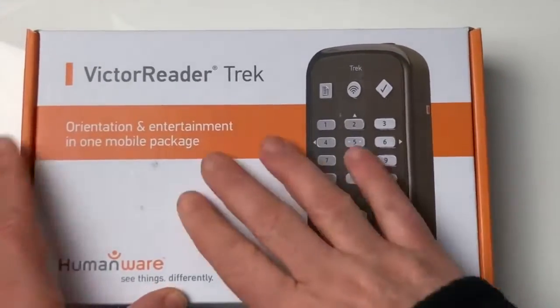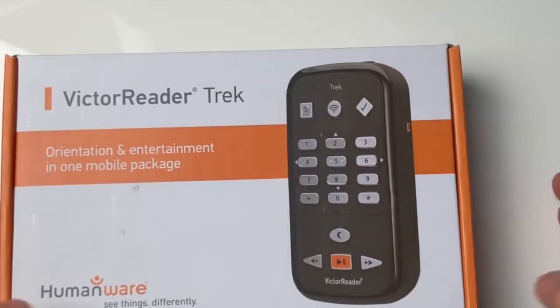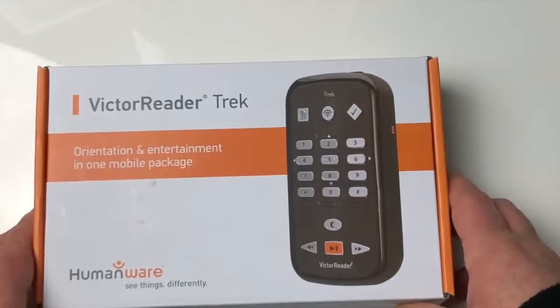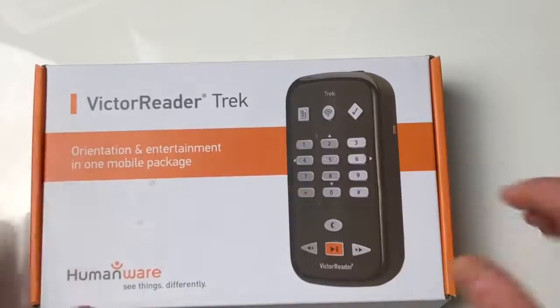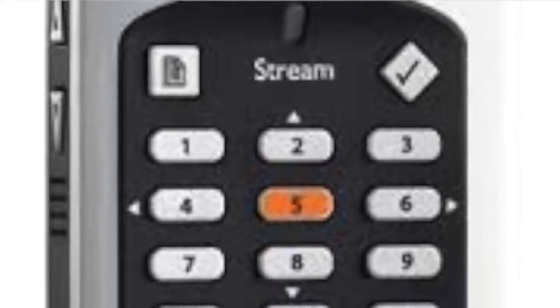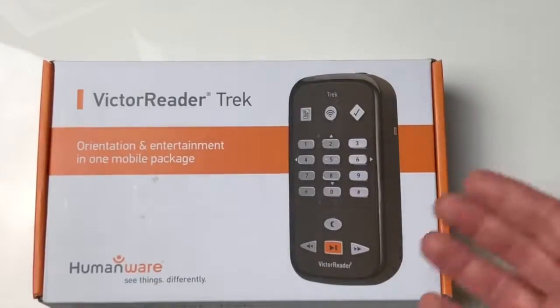Bonjour à tous et merci de regarder cette vidéo, j'espère que vous allez bien. Aujourd'hui on va parler d'un tout nouveau produit qui vient juste de faire son apparition en France : un appareil qui va faire beaucoup de choses, équipé d'un GPS spécialement dédié aux personnes mal et non voyantes. Cet appareil s'appelle le Victor Reader Trek, de la société canadienne Humanware, qui nous avait déjà donné le Victor Reader Stream et le Victor Reader Stratus. Aujourd'hui ils ont amélioré leur gamme avec un outil qui peut guider les gens aussi bien en mode piéton qu'en mode voiture.